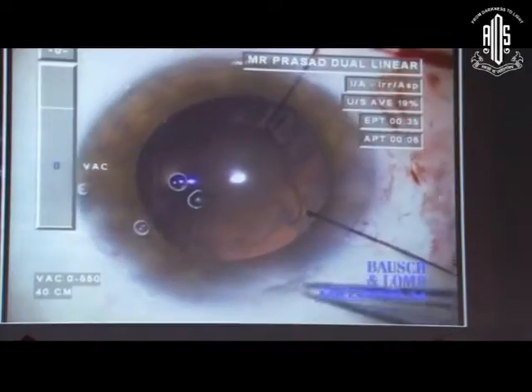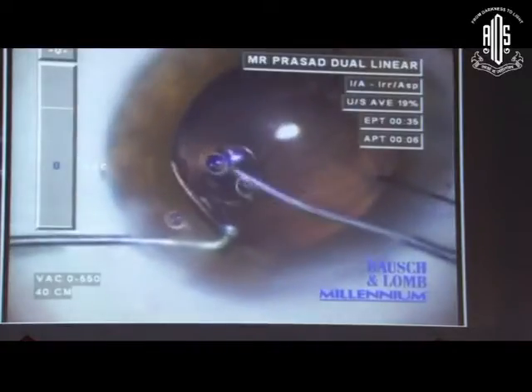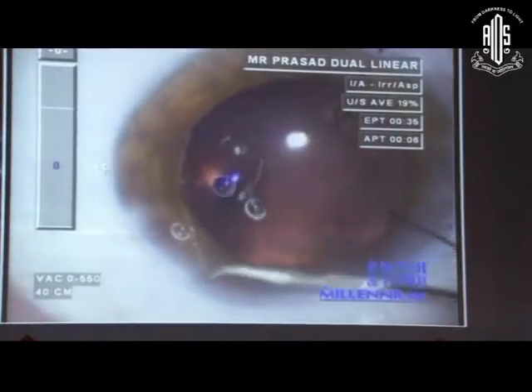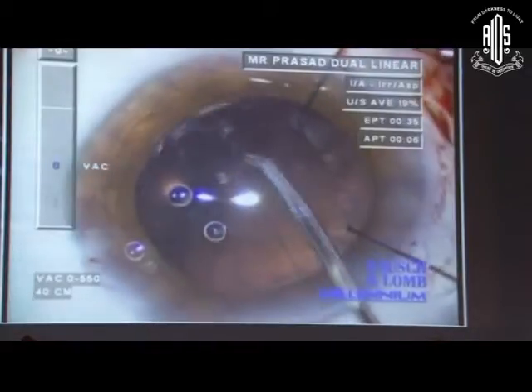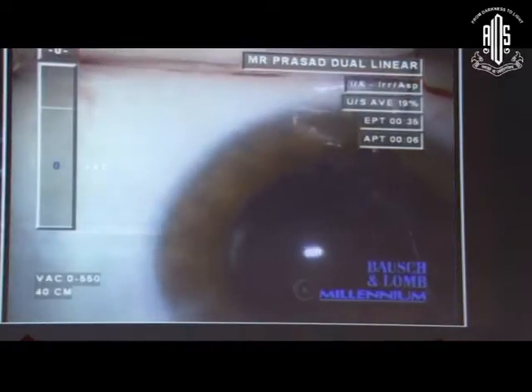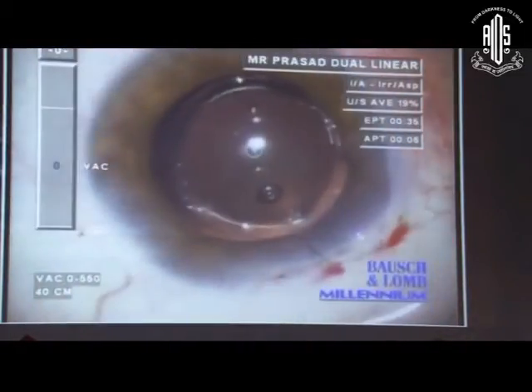Finally, this is a Sioni ring, shown in a similar case, to illustrate why I do not prefer it. It's a much more rigid device — the process of fusing that segment makes it very rigid. I'm struggling to get it in without causing damage; even with two instruments, the edge goes into the anterior chamber angle. And once it's in the bag, my job is not done — I then have to rotate that rigid device to the area where I want to suture it. You can imagine the additional shearing that causes. In my mind, you may actually be weakening more zonules rather than protecting them. I'd rather use the segment: a small device that can be placed without pushing on zonules anywhere.